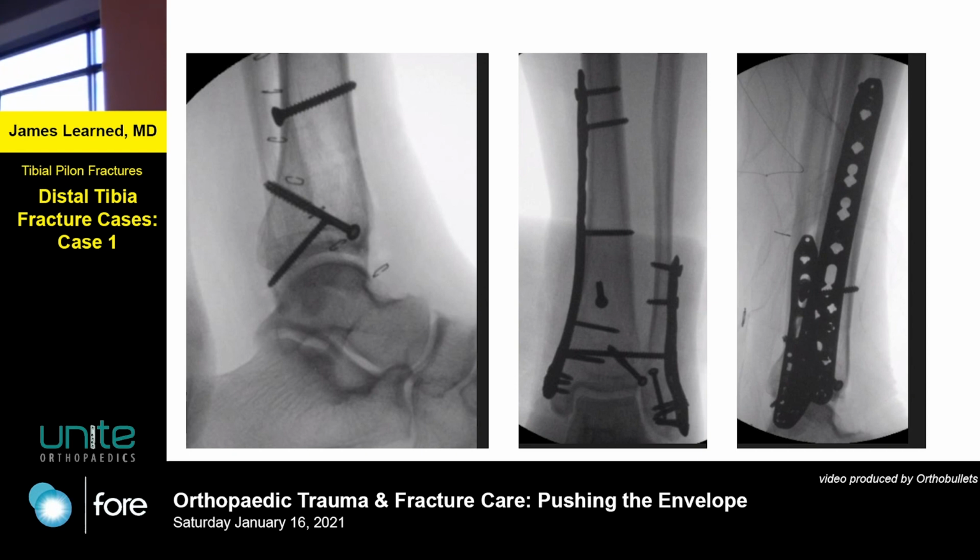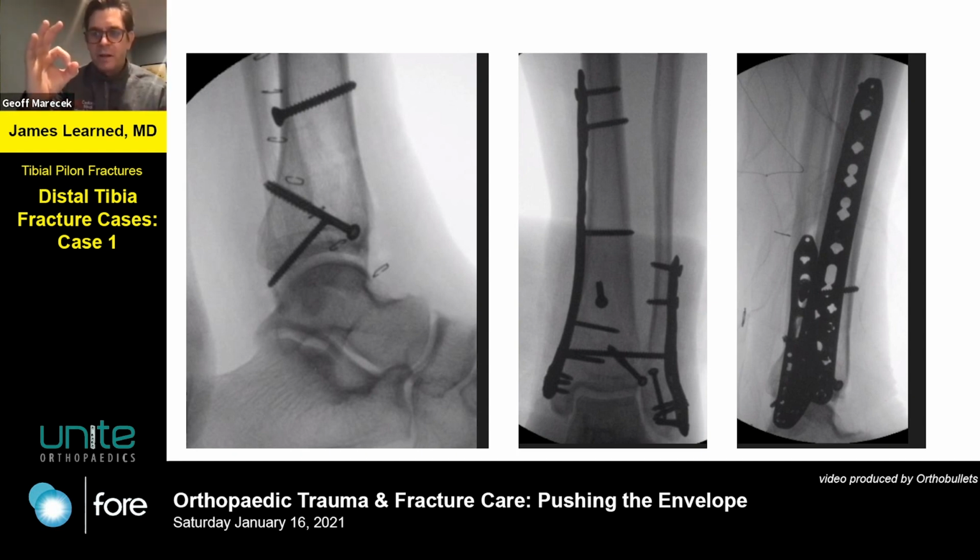While you're pulling that up, I could not echo more the length sentiment. I teach our residents, if you see the dime sign of the distal fibula, then you've got to break that and keep pulling, and then you're far enough. Yeah, if you think you've got it out to length, add more. If you think you might be a little bit long, you're good.